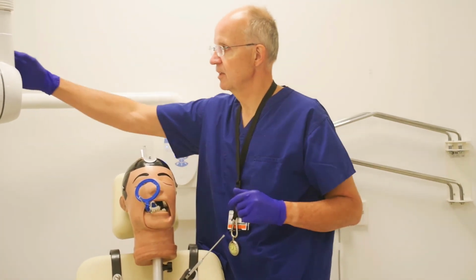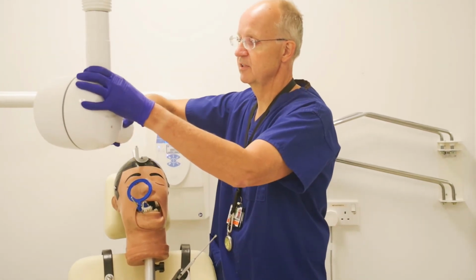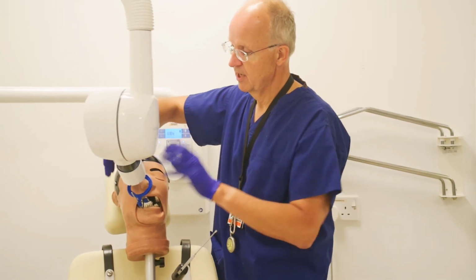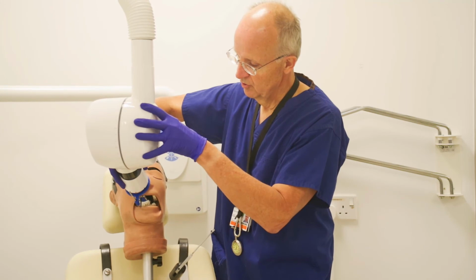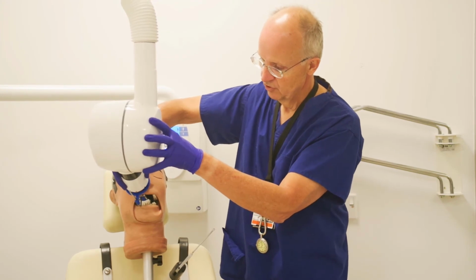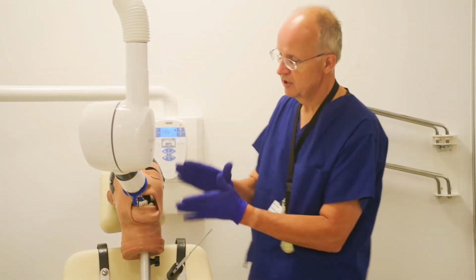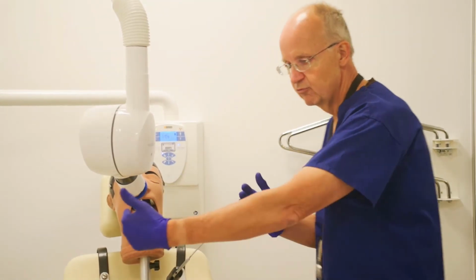And again, we're following exactly the same principles that Carlin showed you a couple of minutes ago when we did the posterior teeth. We're just going to line the X-ray machine up using those lines on the side. So I'm now looking at my vertical angulation here, making sure that that's nicely lined up. That's looking good.